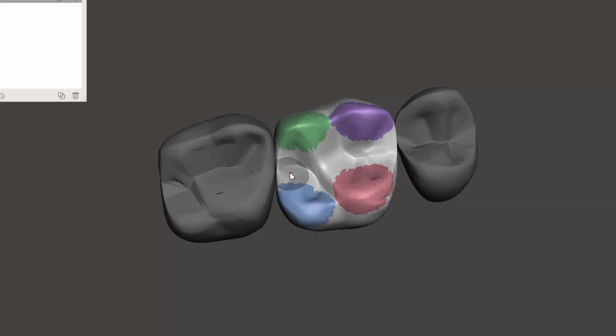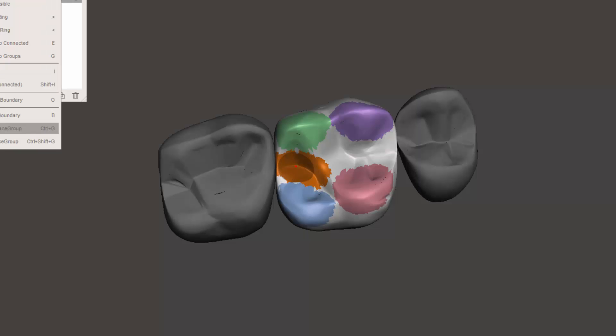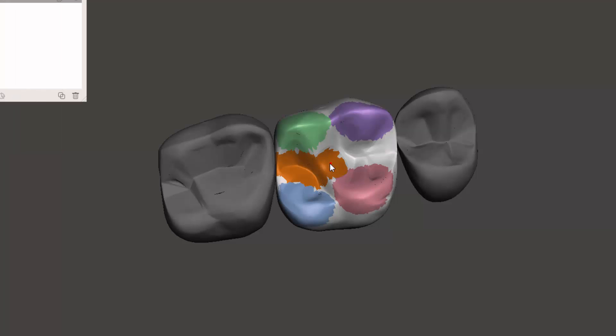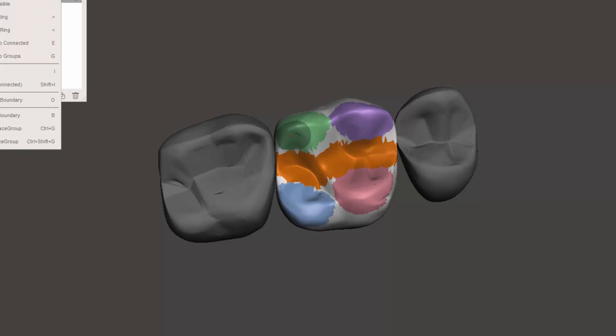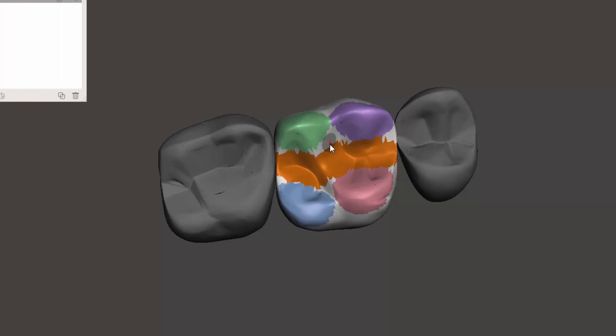And then lastly, I'm going to go ahead and select the grooves. I'm going to get the majority of it first, and then I'm going to go through and kind of fill in the gaps a little bit by making this brush a bit smaller.